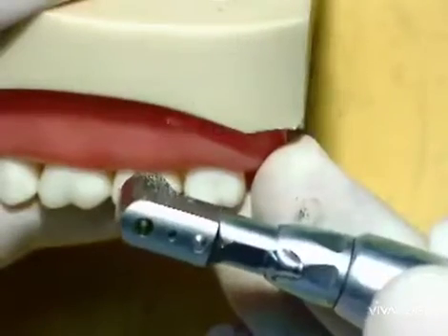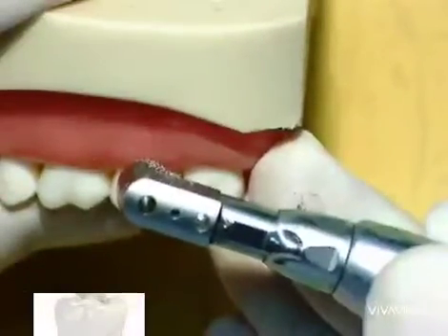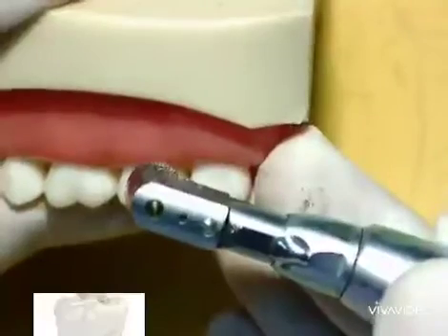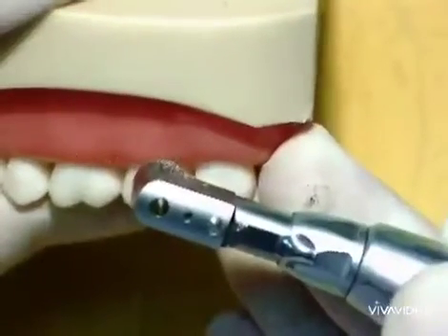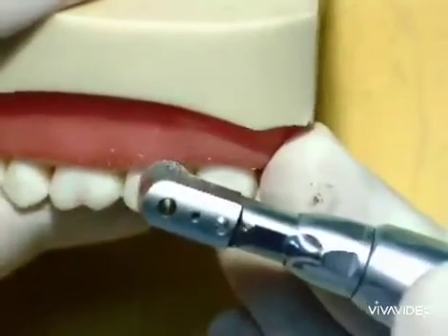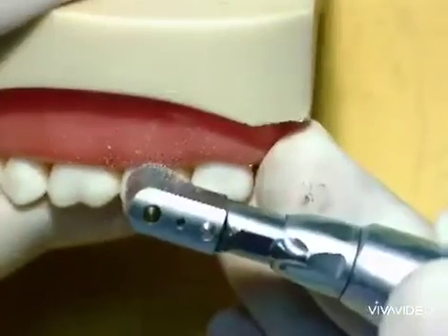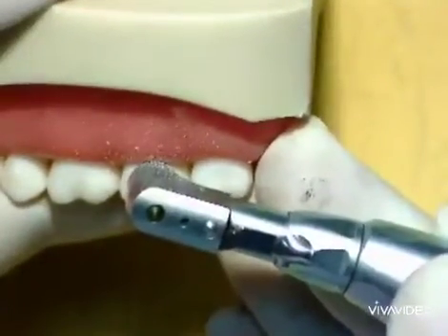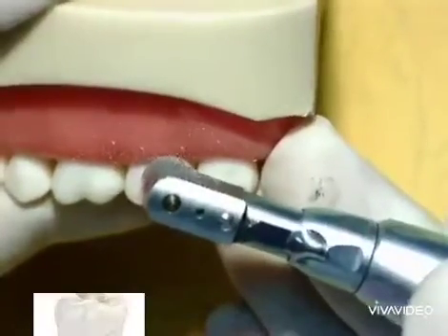Then we switch to a fissure bur in order to prepare the outline form. The outline form of Class 5 cavity is usually trapezoidal, rounded at the gingival one-third of the tooth.